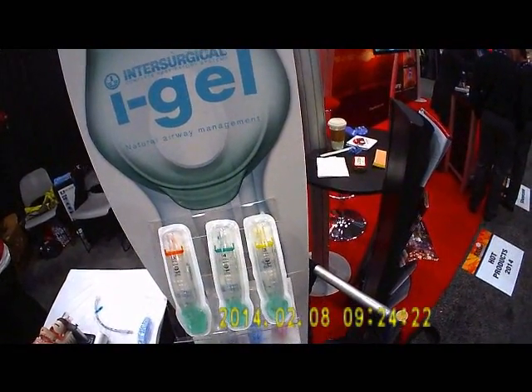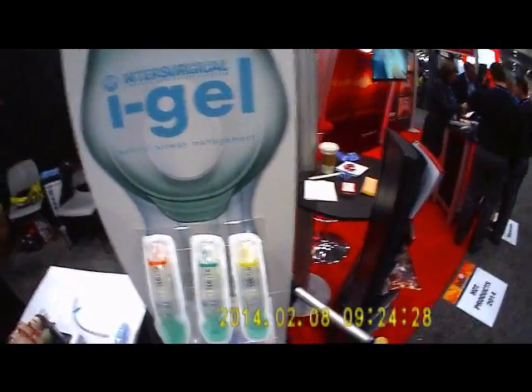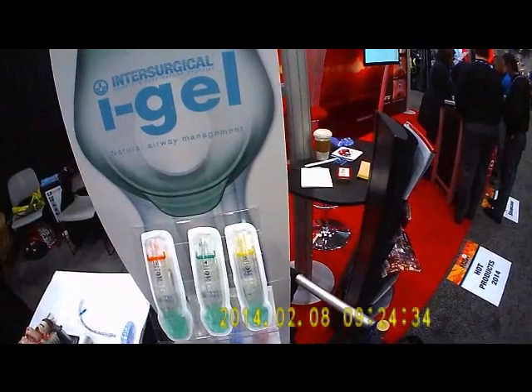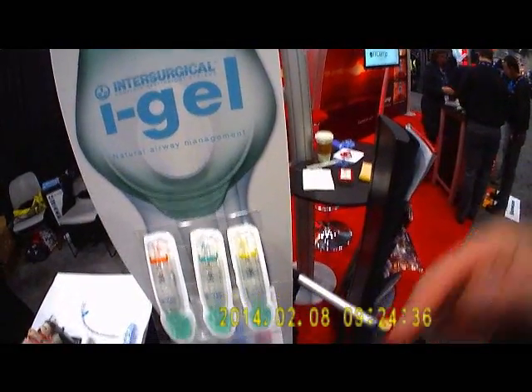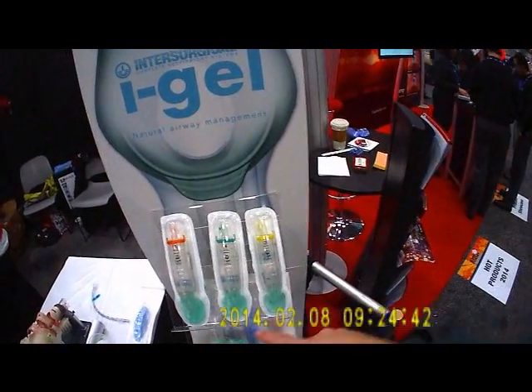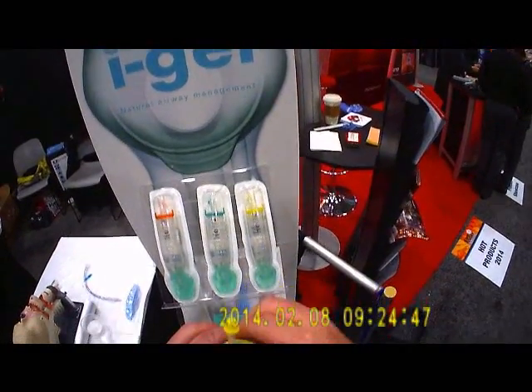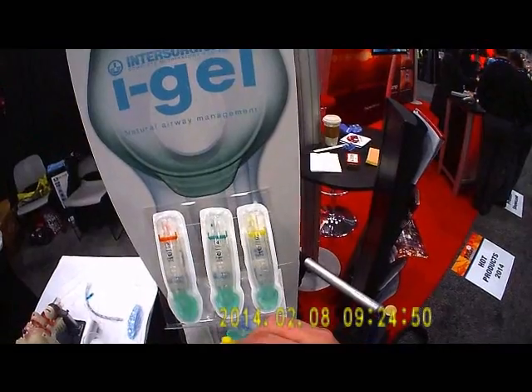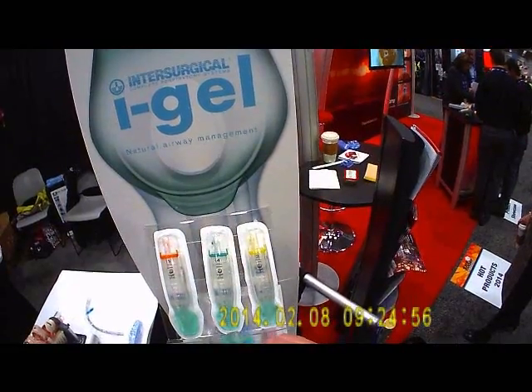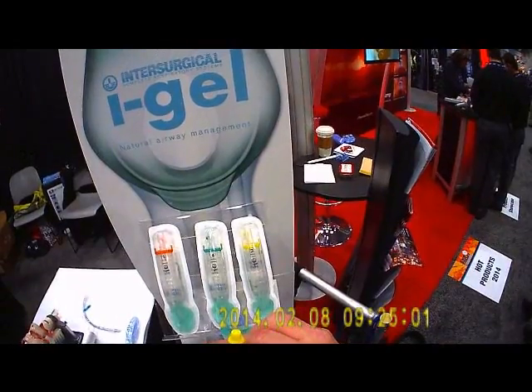When the paramedic comes along, if a first responder or EMT inserted the iGel, the paramedic can either choose to continue ventilating through the iGel through the standard BVM adapter, or he can insert an endotracheal tube down through the iGel and intubate the patient through that. It's got a rigid bite block up top so the patient can't bite through it and clamp down.